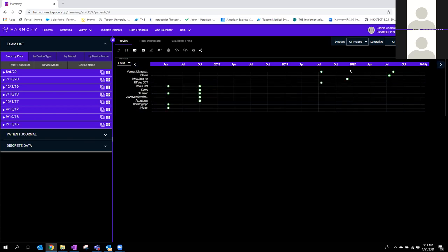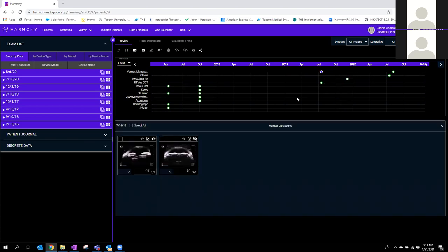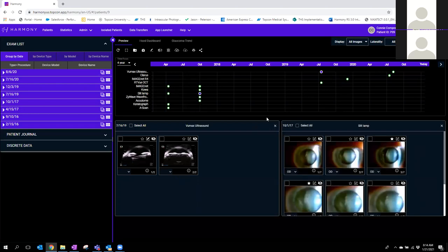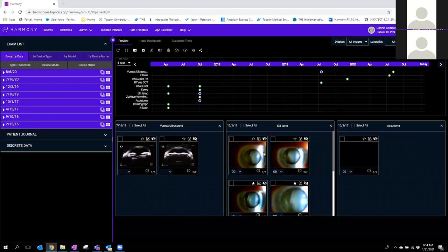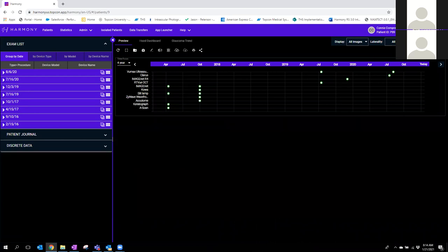The timeline is interactive — you can click on it and populate thumbnails below for a quick preview, and you can double-click to make them larger. You can click on different radial buttons to populate your screen below. It highlights in purple which ones you're selecting so you know what you've chosen, and you can deselect or hit clear exams. A really useful feature: you can select the modality name itself and get the entire history. So if you want to look at all fundus images for a patient, just click on that modality name and you get the full range.